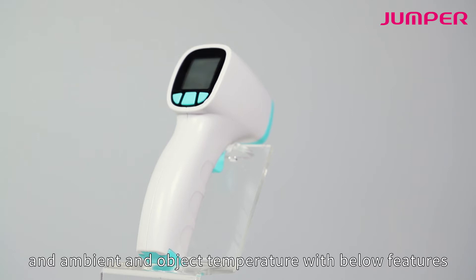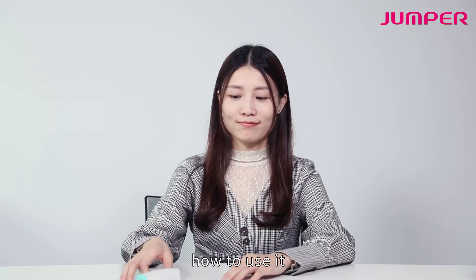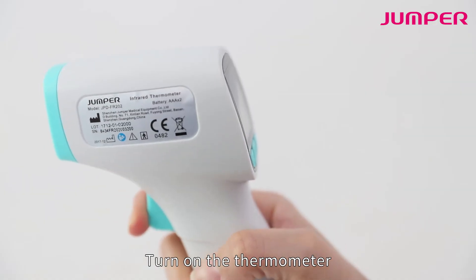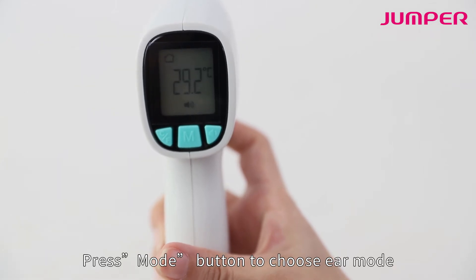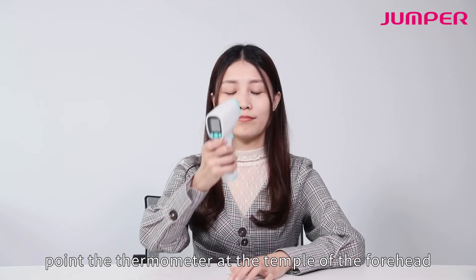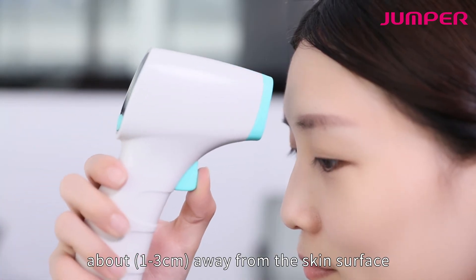To use it, please follow along. Turn on the thermometer. To measure forehead temperature, press the mode button to choose forehead mode. Point the thermometer at the temple of the forehead, about 1 to 3 centimeters away from the skin surface.